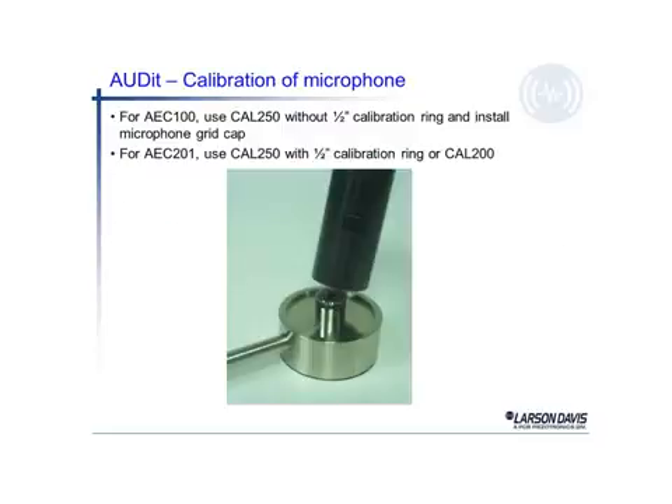To calibrate the audit system, everything is referenced to an acoustic calibrator. In this case, the model CAL250 is our reference — we place that over the microphone. There have been users who attempt to set the CAL250 on top of the one-inch mic because there's a calibration adapter in the way. The user needs to remove the half-inch adapter ring for the CAL250 to fit down over the one-inch microphone. About a 10 dB error is introduced with that scenario.